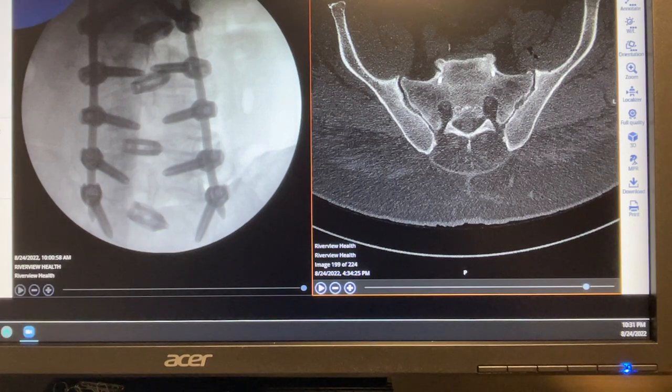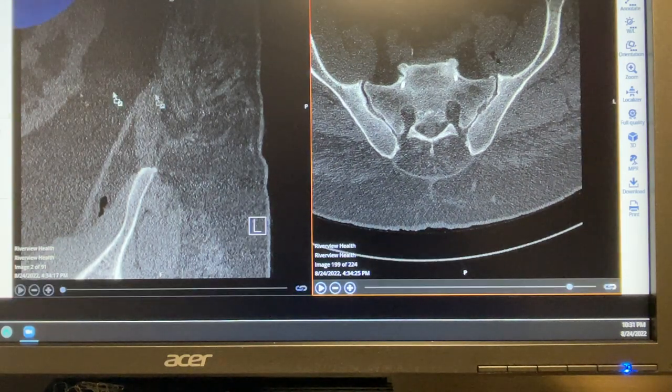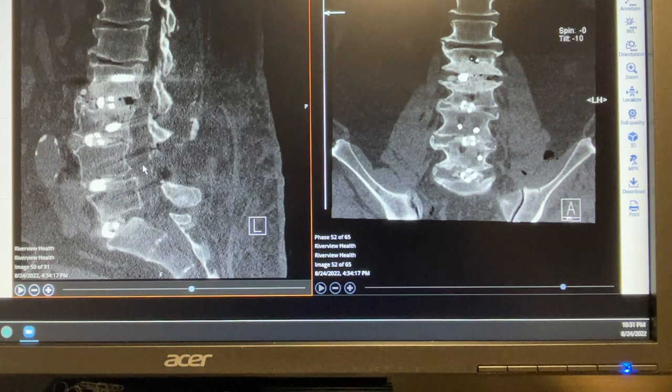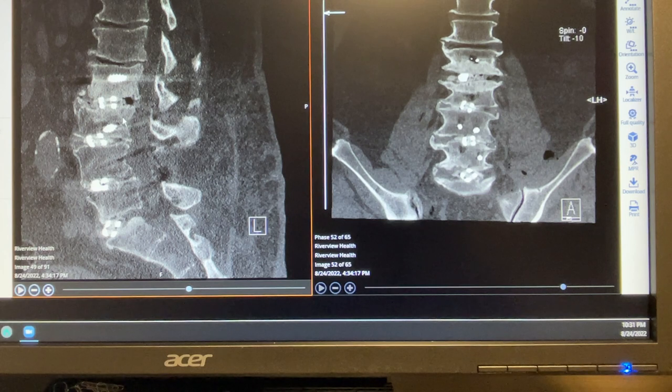The sagittal and coronal views show the disc space is distracted, anatomic decompression is achieved, and significant alignment correction is achieved. More important than that — I visited the patient three hours after surgery. He ambulated, his radiculopathy is gone, and most of the back pain is resolved. He was smiling and literally making jokes with me. This patient will be discharged tomorrow morning — a patient with high BMI where surgery very justifiably could not be done with traditional techniques.